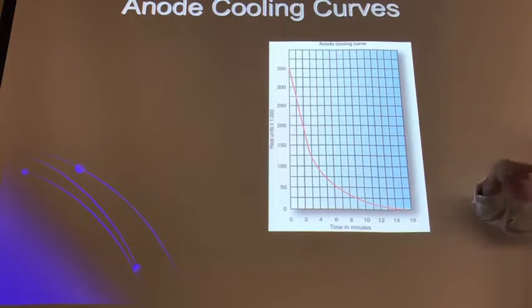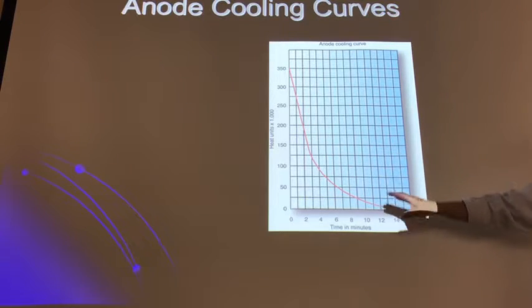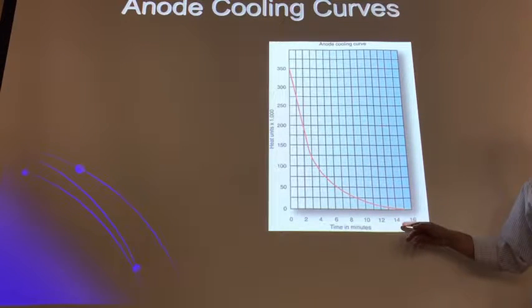And so now, technology is a little bit better, and so you have quicker cooling times. So you might not need to wait an hour. I mean, this is what, 15 minutes, this is 2 minutes, but who's going to wait 12 minutes for the tube to cool off? We used to do that in CT, back in the late 80s. If you did an abdomen, for example, you only did about 10 pictures, and then you waited for this thing to cool off. You waited, and then did another set, and you waited. So CTs were very slow.